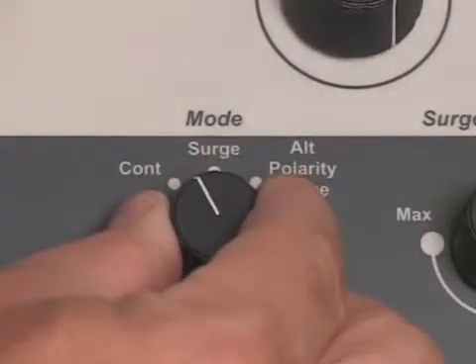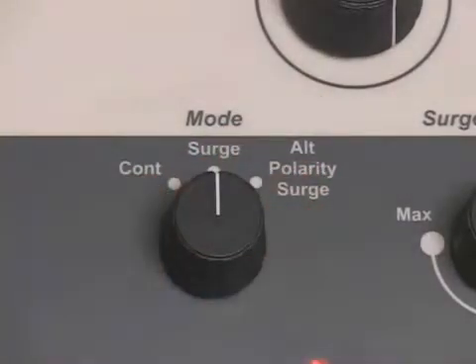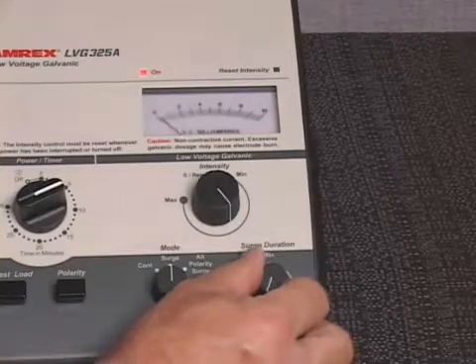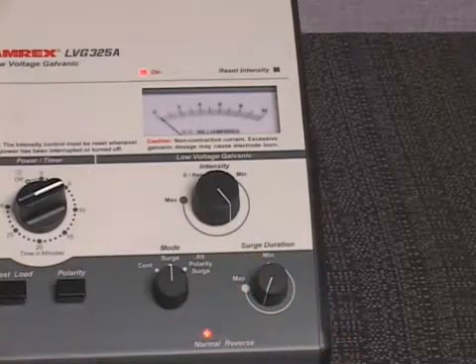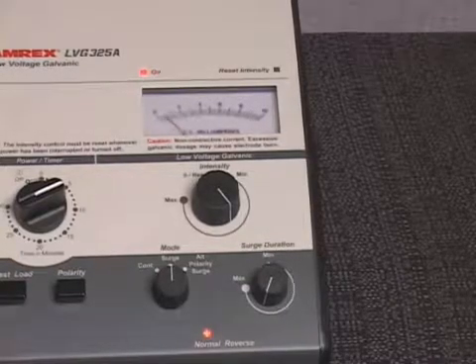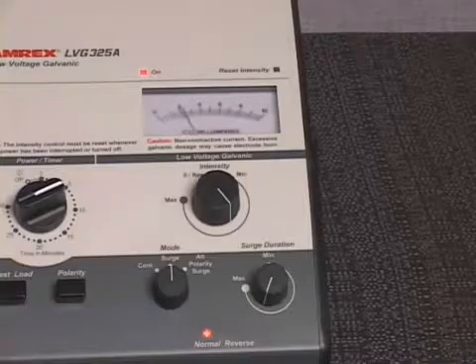If desired, select an alternate low voltage galvanic output mode: surge or alternating polarity surge. Adjust the low voltage galvanic surge duration control to regulate the surge duration or alternating polarity surge duration. The output rate selected is indicated on the low voltage galvanic meter dial.